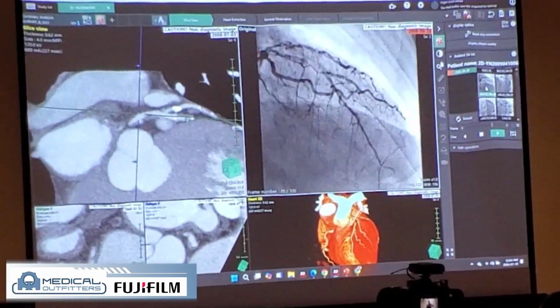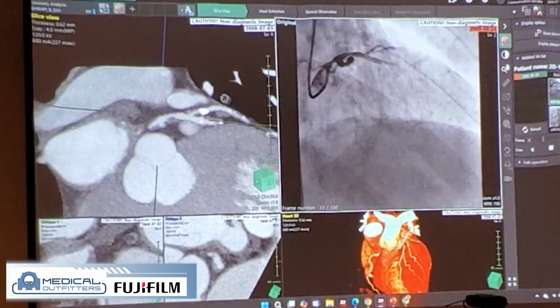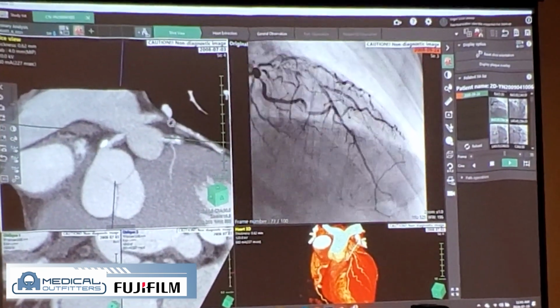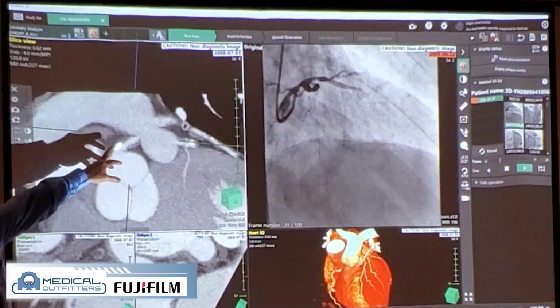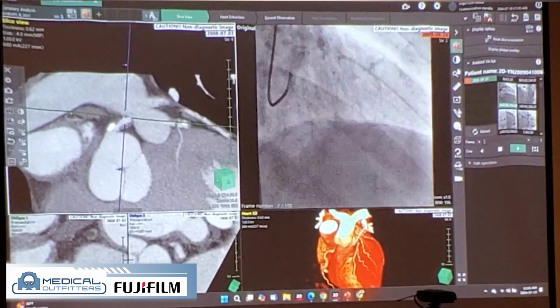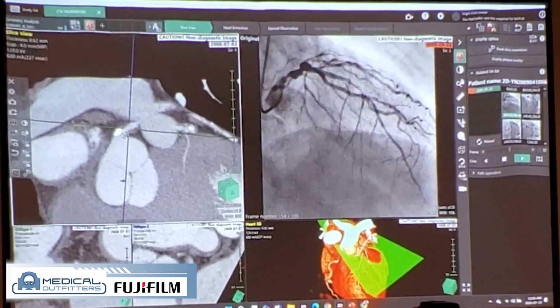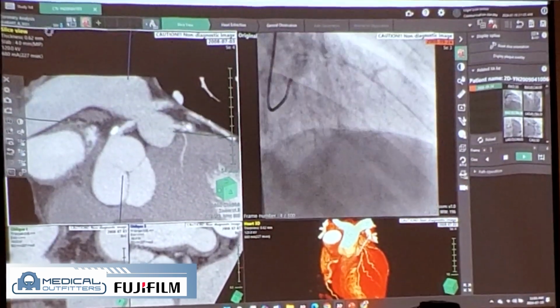The way that these CTs work, for those that don't typically read these every day, is you start at a head first position like this. You want to start out at the ostium of the left main. You can see there's a little bit of atherosclerotic disease here. A little bit of soft plaque happens to be sitting here on this patient as well. What we would do is grab onto the center of this and put this as our pivot point for the vessel. So now I've thickened this up.